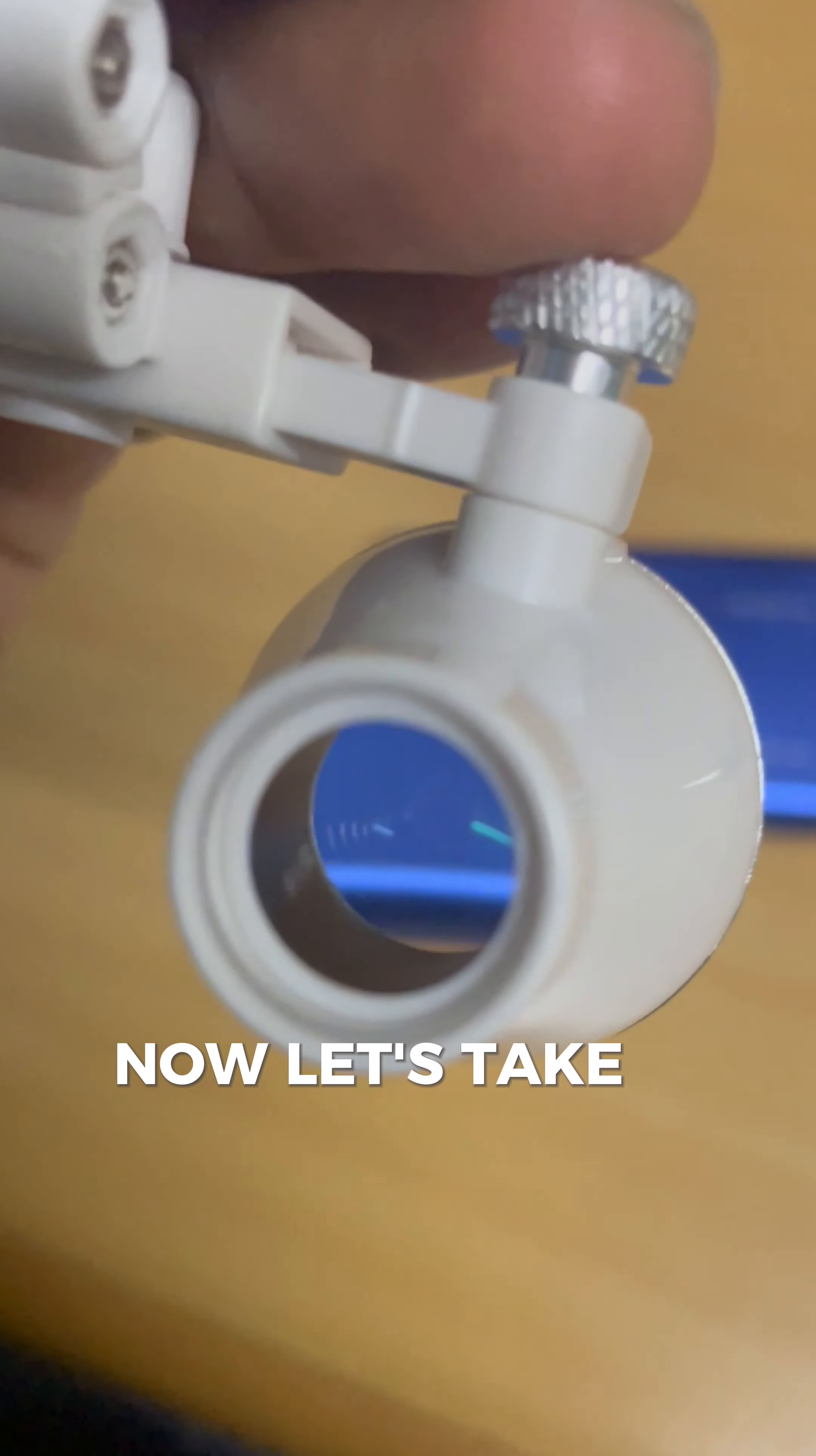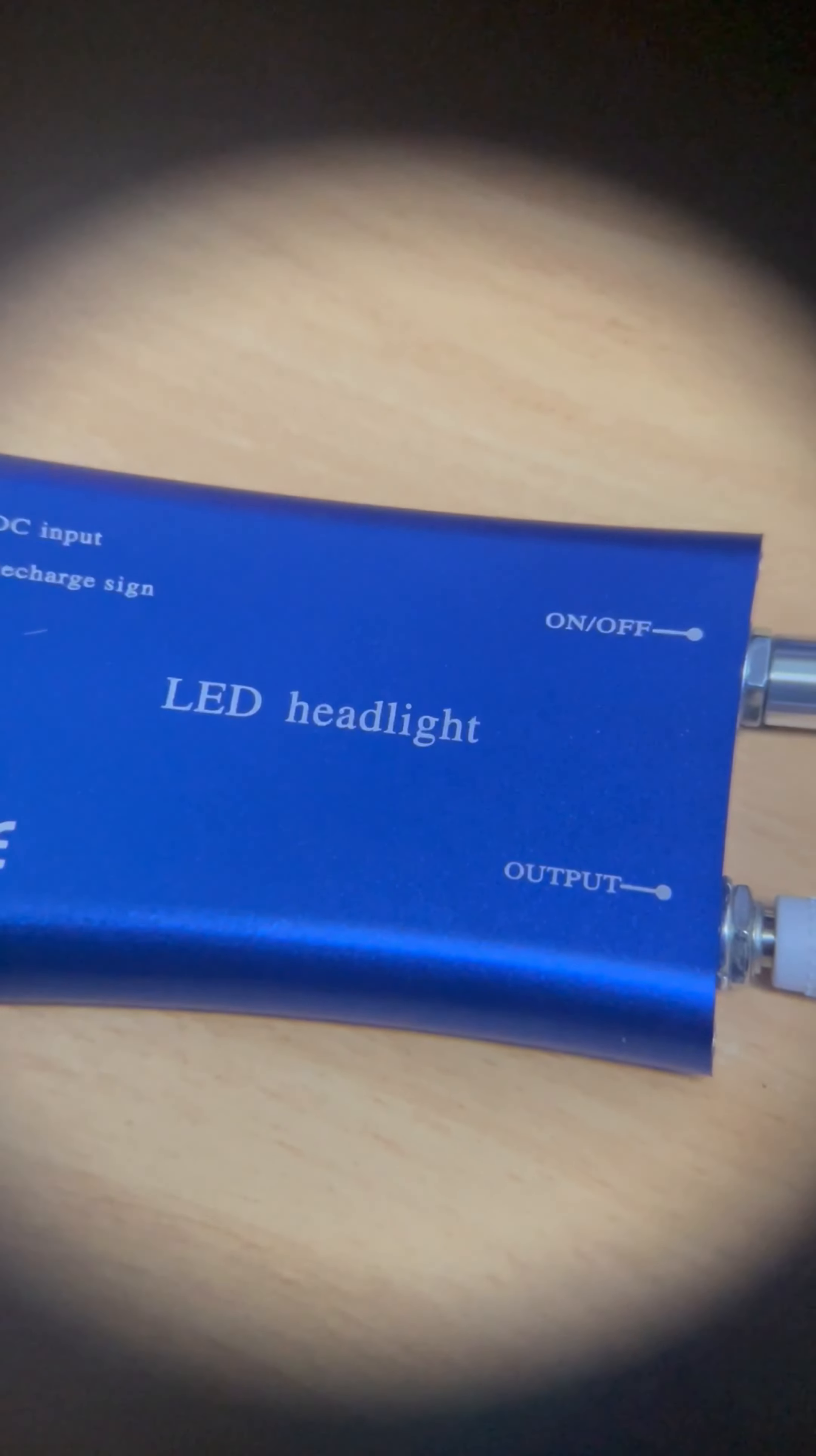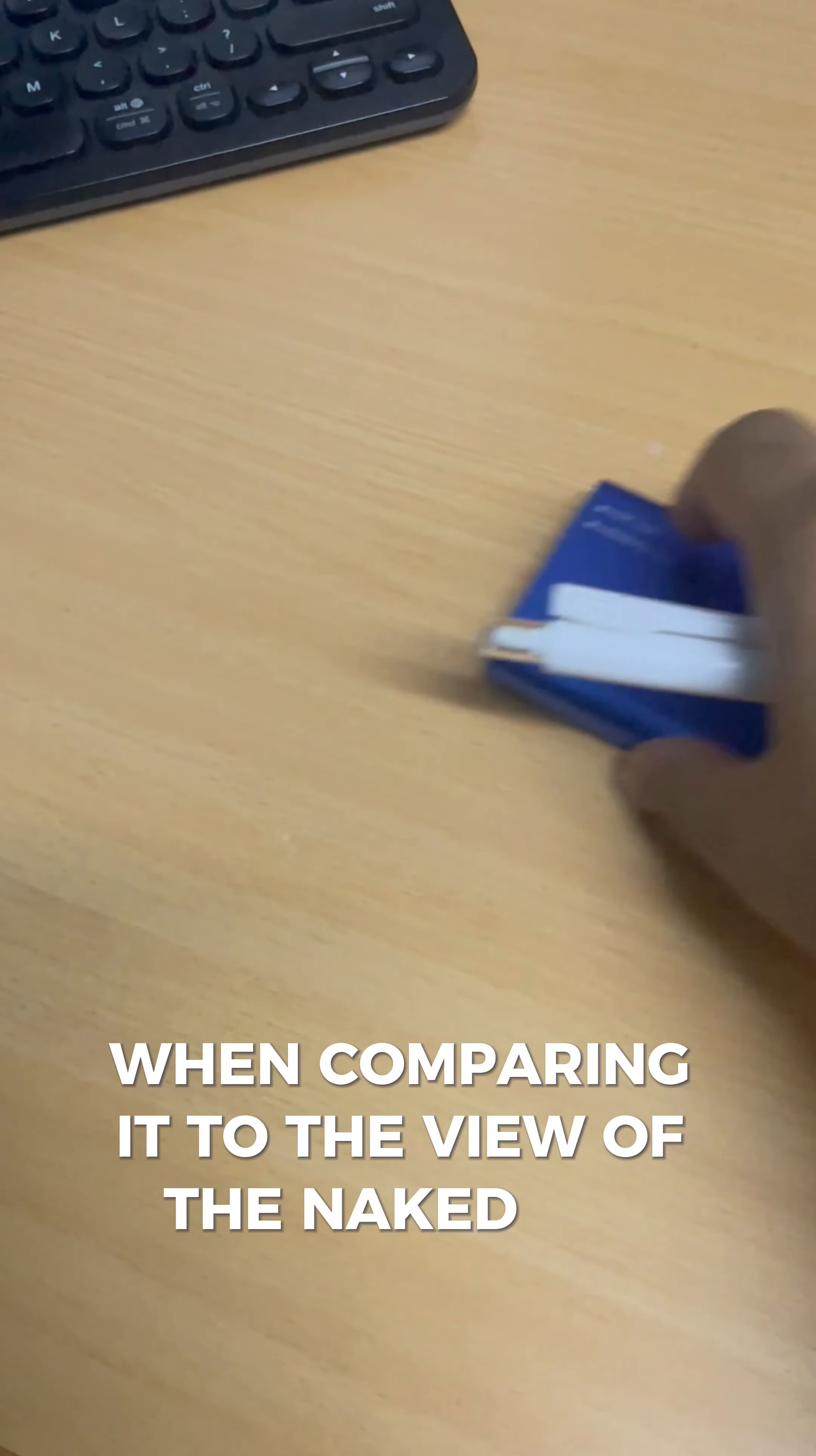Now, let's take a look at the magnification. This 3.5x magnification is great for examining smaller details with clarity. Let's look at the battery pack here. You will notice the difference right away when comparing it to the view of the naked eye.